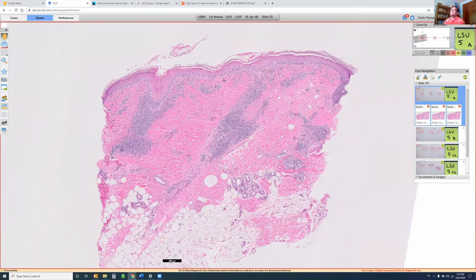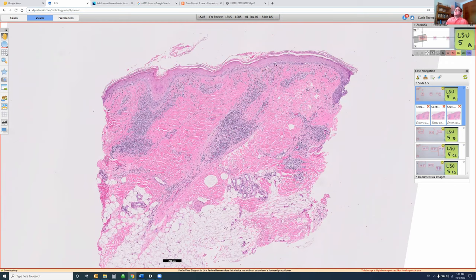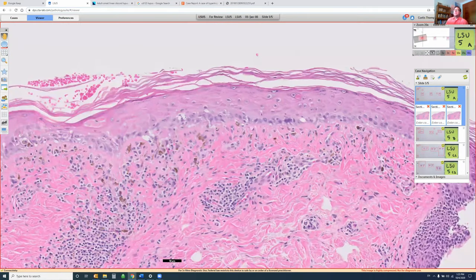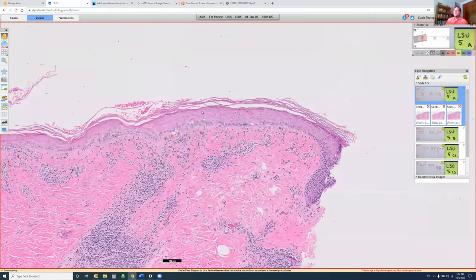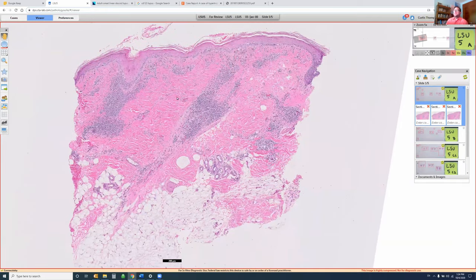Bernard Ackerman's classification started with classifying the infiltrate as superficial and deep, but we tend to look at the epidermis first and ask: is it normal, is it altered, and if altered, in what way? This is clearly not normal. We can go to an interface dermatitis here. You have a superficial and deep infiltrate, slightly deep, and you can see these are where hairs are. This is perifollicular, and it's almost getting down into the subcutis.